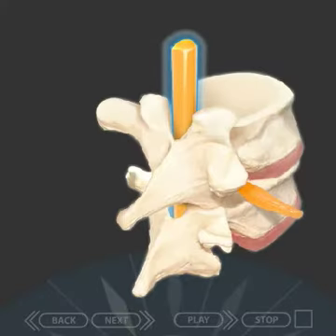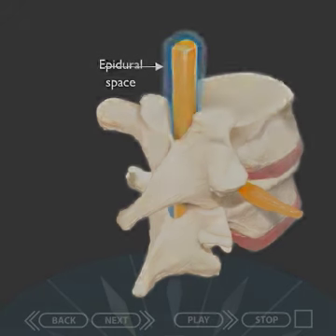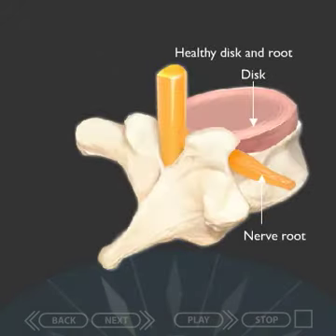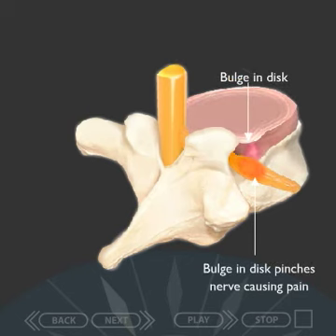One of the most conservative options to treat disc-related pain due to disc bulging and/or degeneration is epidural steroid injections. The epidural space is the medical term for the space surrounding the spinal cord. Placing anti-inflammatory steroids into the epidural space helps reduce inflammation and reduces the size of a bulging disc. This in turn reduces pressure on the nerve root, which reduces the pain, weakness, and numbness often associated with disc-related problems.